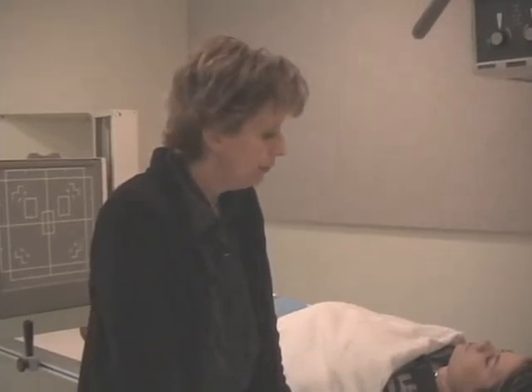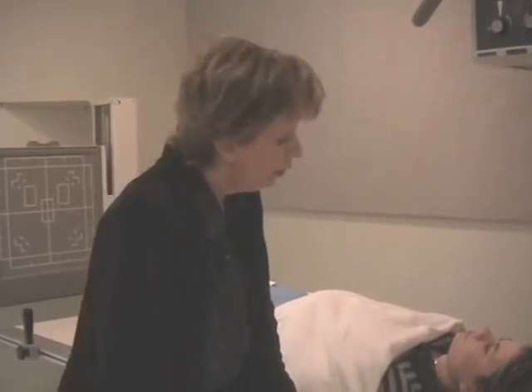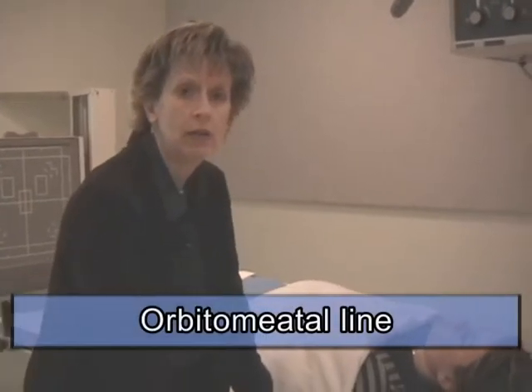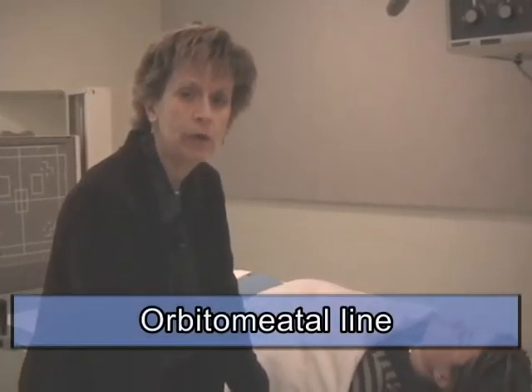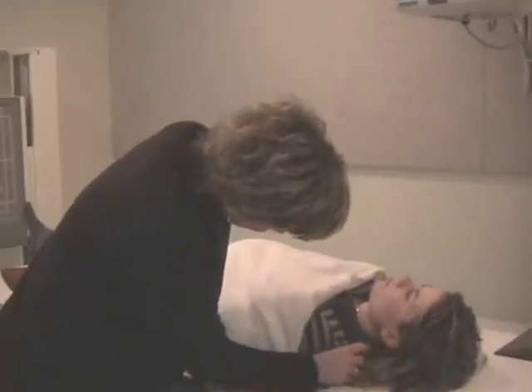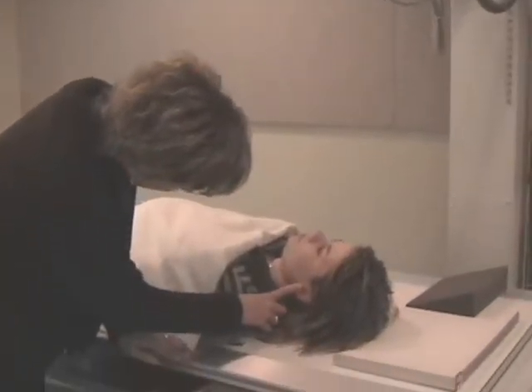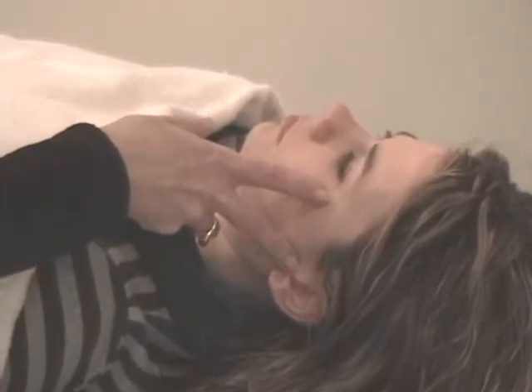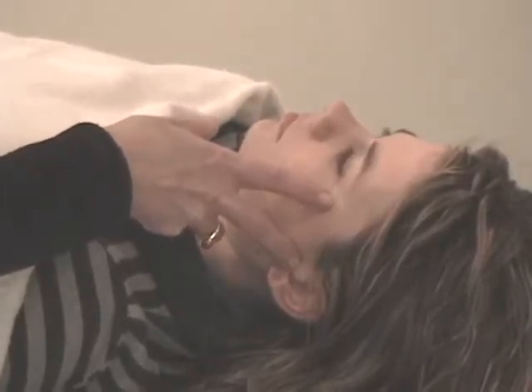We're going to look at an AP projection first, and one of the first things that you have to do is look at the orbital meatal line, the OML. You will look for the ear and the channel, the external auditory meatus, and the outer canthus of the eye. And you can see that that is not perpendicular. It's at an angle.